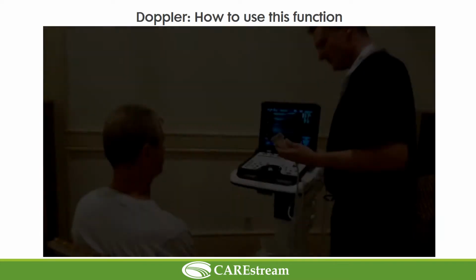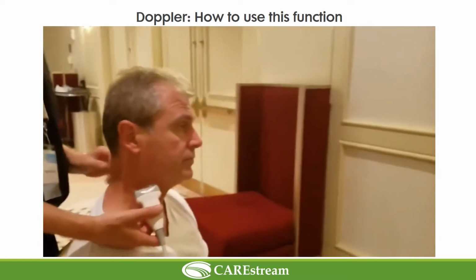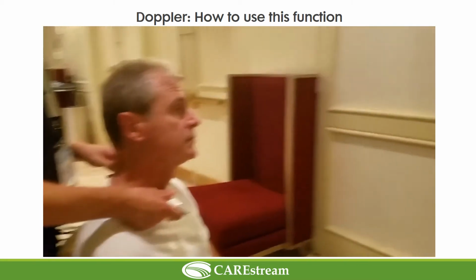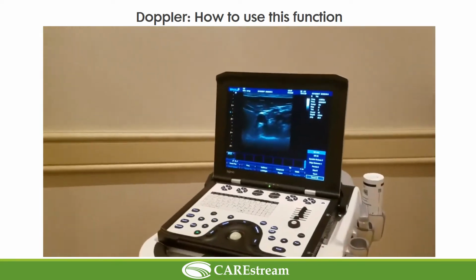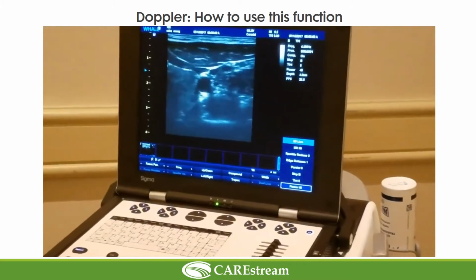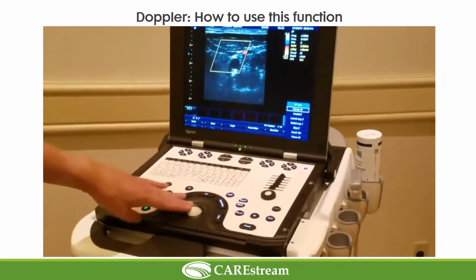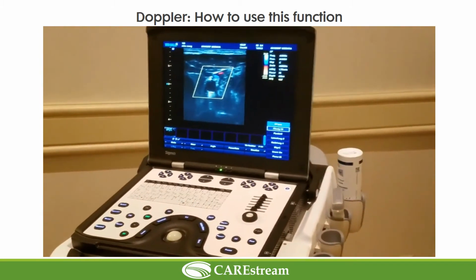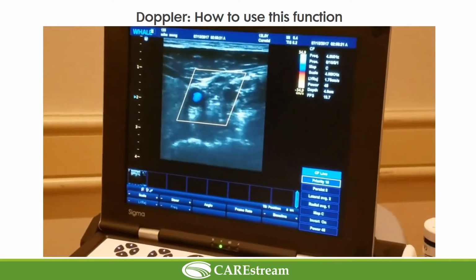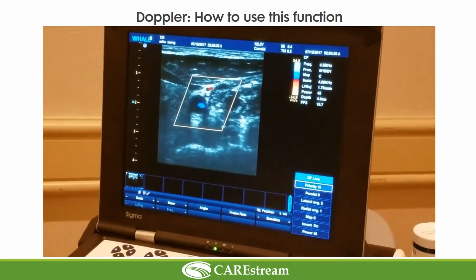Successful. We're going to basically, on the anterior lateral of the neck, above the collarbone, put the probe on there, and right in the center of the screen, we can adjust the brightness. There's our carotid artery pumping away. If we want to see it with color, that's the jugular vein, and there's our carotid artery.